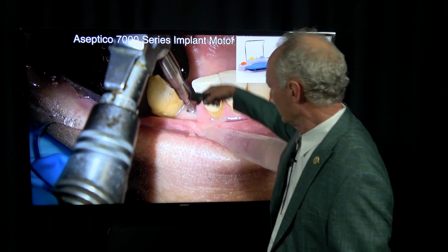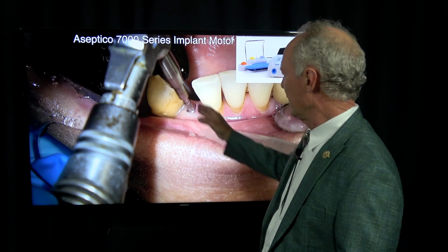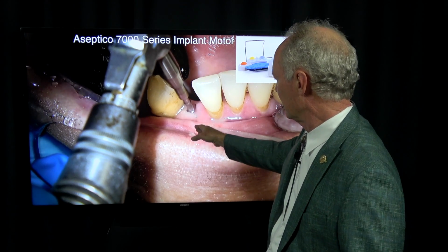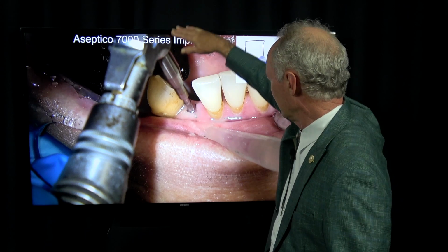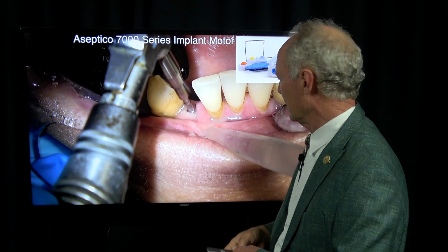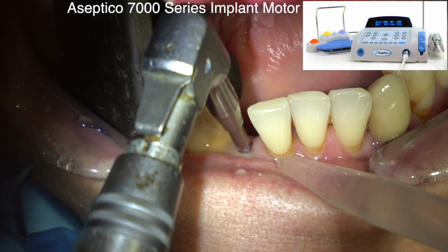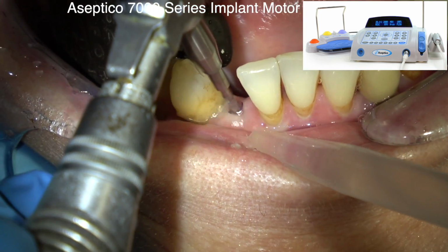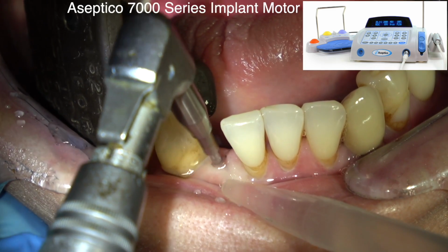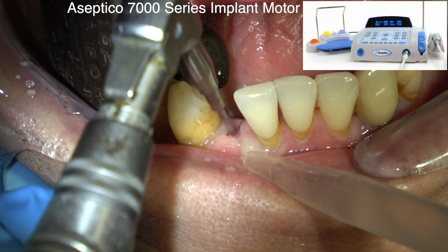You also don't want to drill through the facial or through the lingual. So you may even take the pilot drill out of the handpiece and look at it from the incisal with the mirror to be sure it's aligned, the mesial, distal, and facial lingual appropriately, because you do not want to drill through the lingual part of the alveolar process or the facial part, and you don't want to drill into adjacent teeth.